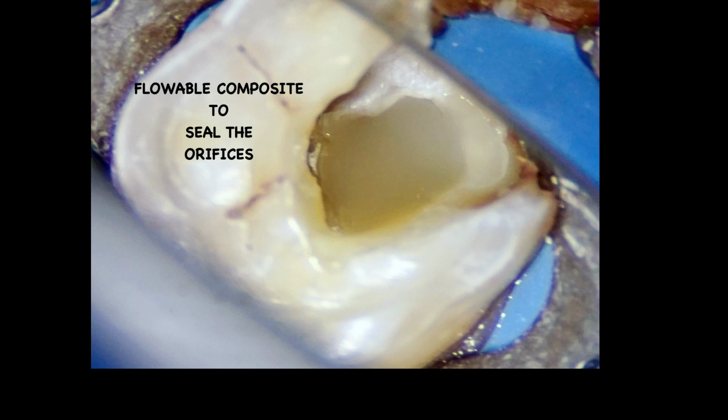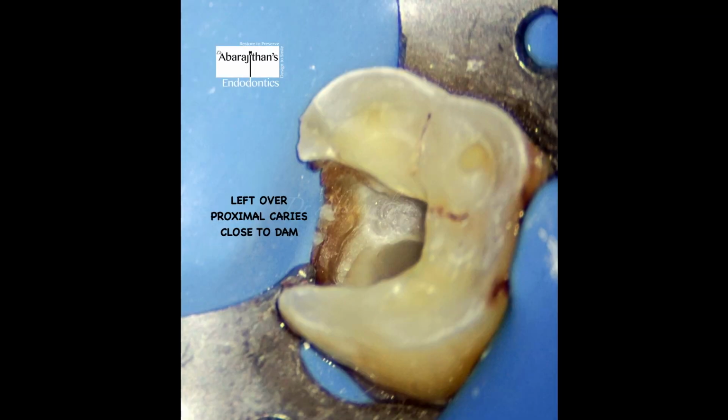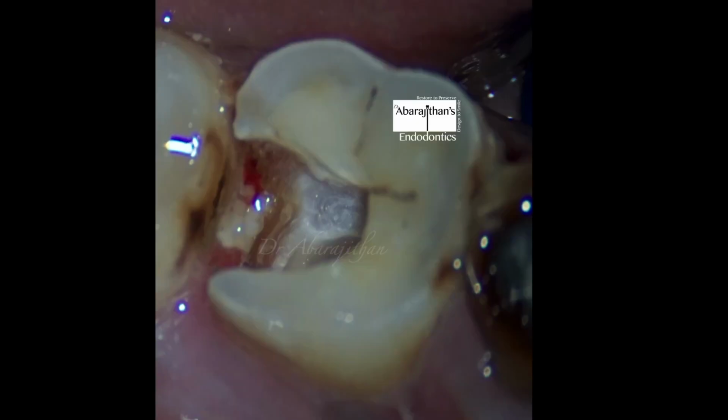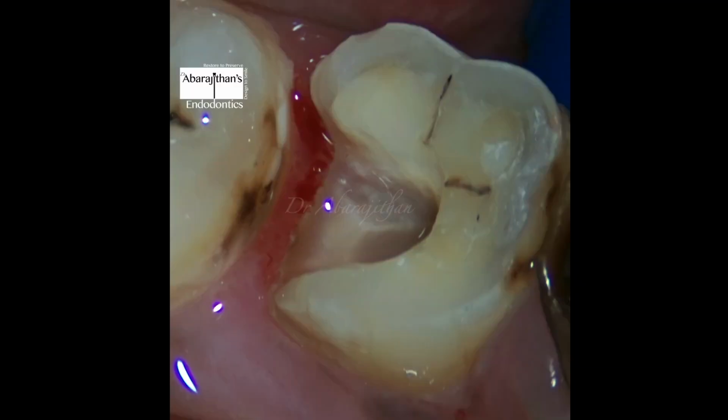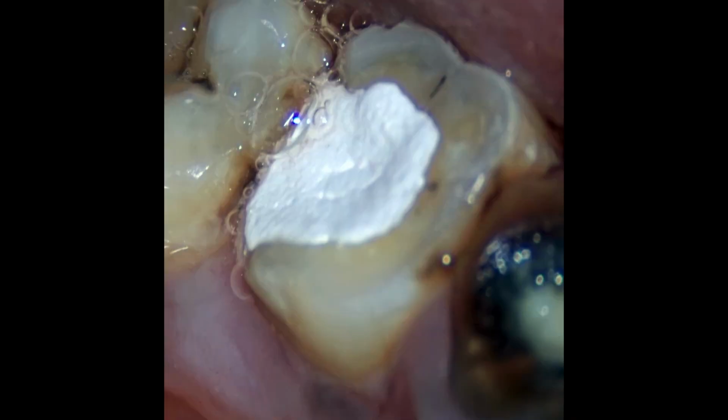So at this point of time, I can remove the rubber dam and address the caries that is present in the gingival seat, which we had intentionally left behind at an earlier point of time. So you can see here, now we remove the rubber dam, and now I can use my long neck burs or my conventional burs and remove the caries that was left behind and also do any gingivectomy if needed, so that in the next visit it's going to be much easier for us to design our final restoration.